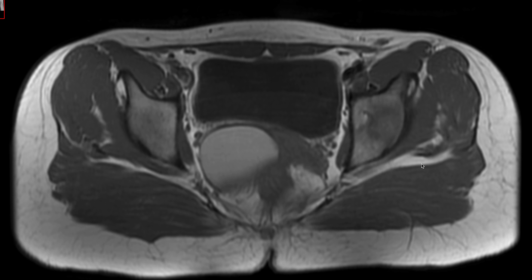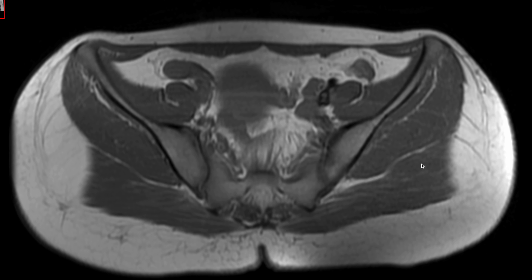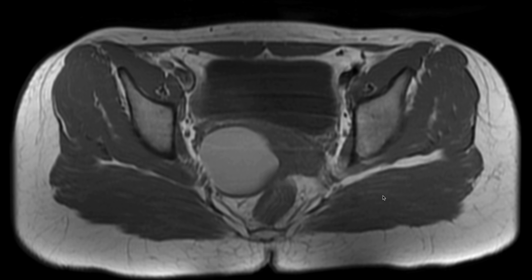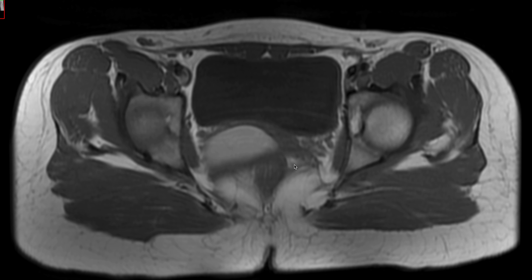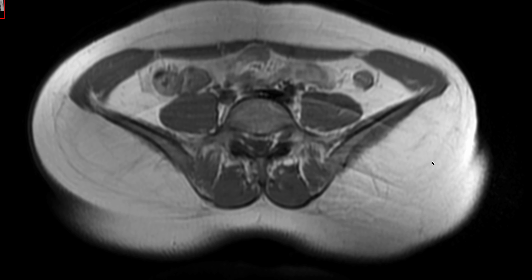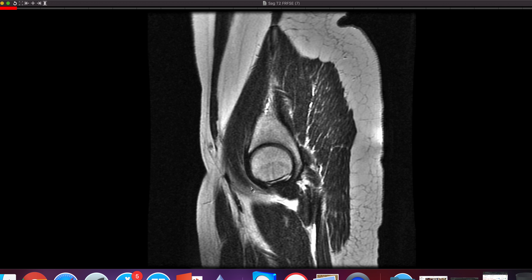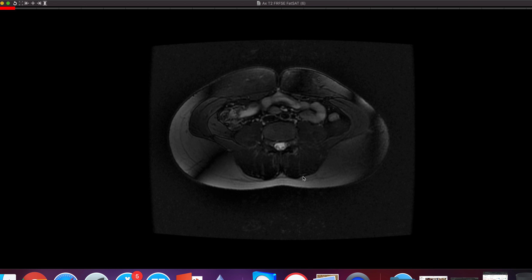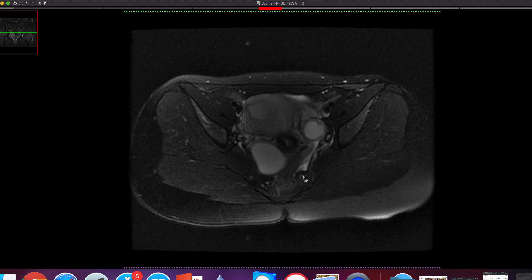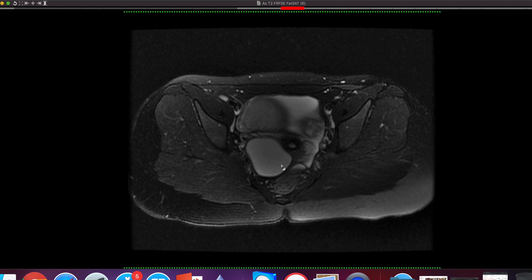The patient underwent a routine abdomen scan where a large cystic lesion was found in the region of the vagina. MRI was performed for confirmation. On the first axial T2 fat-suppressed images, the lesion is hyperintense.